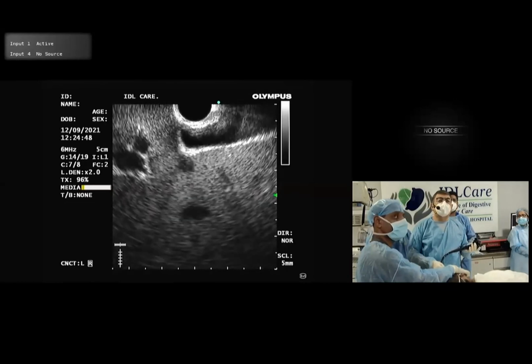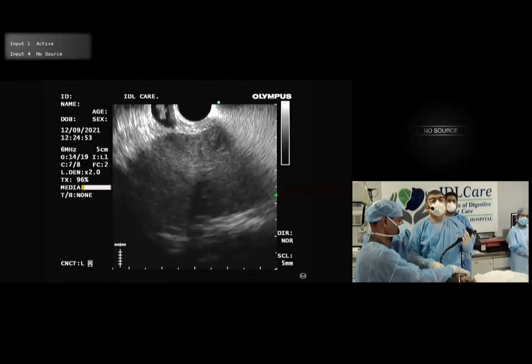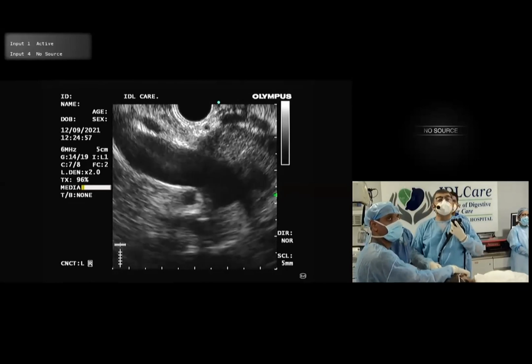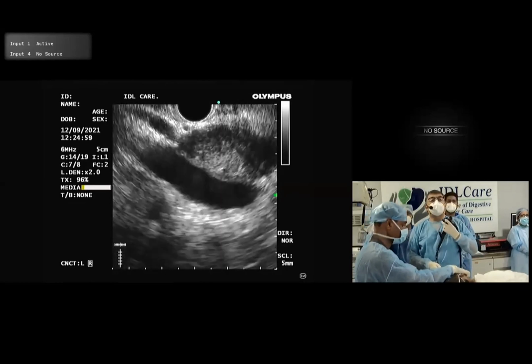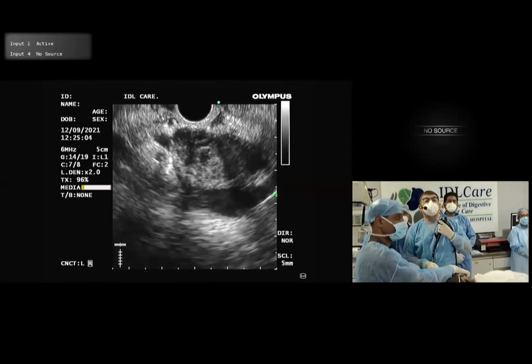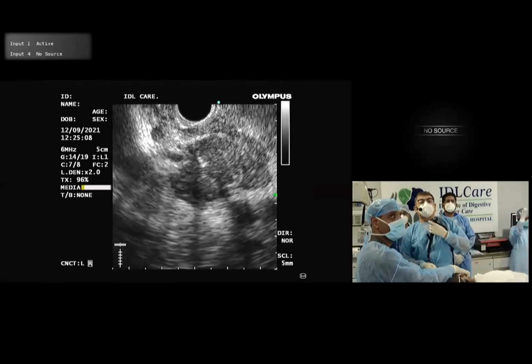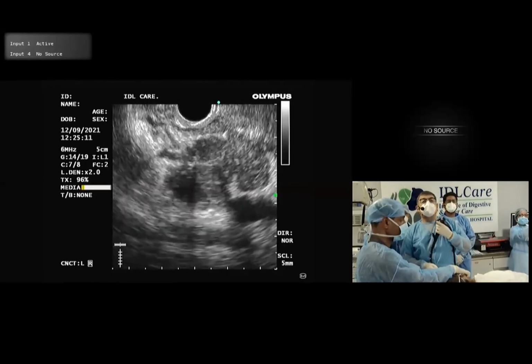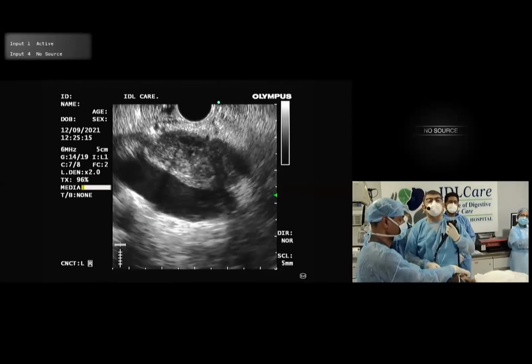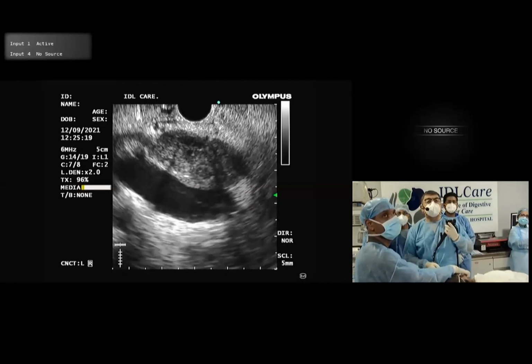Segment 6 here. Again turn clockwise. And you see the head. I actually don't feel like biopsying the head. It looks pretty okay to me from here. This is the head. So probably this is not a mass, and I think this is an important information that we are giving to this patient because doubts were raised whether this is a malignancy.